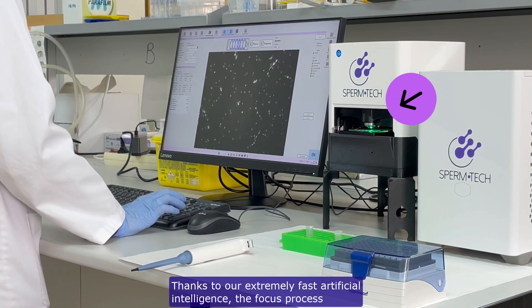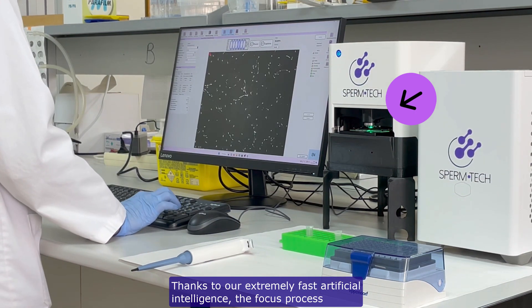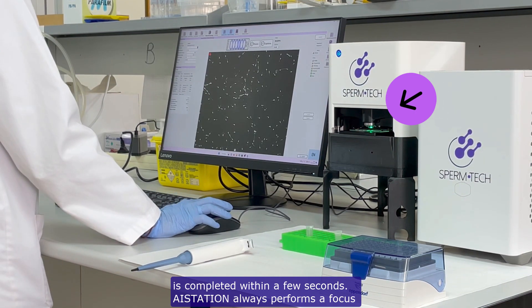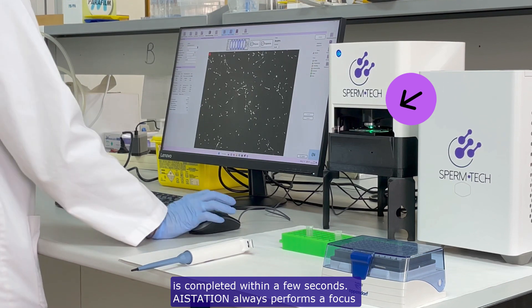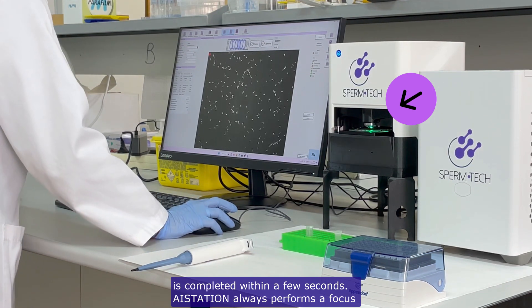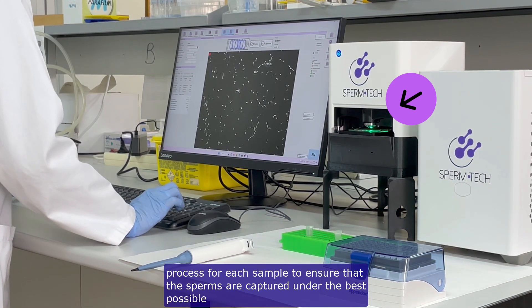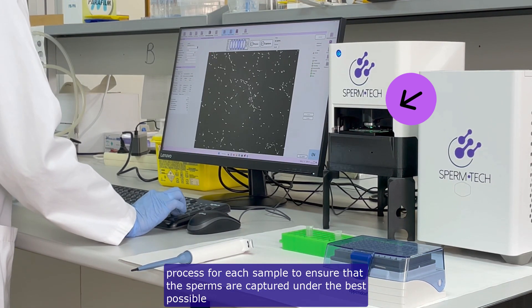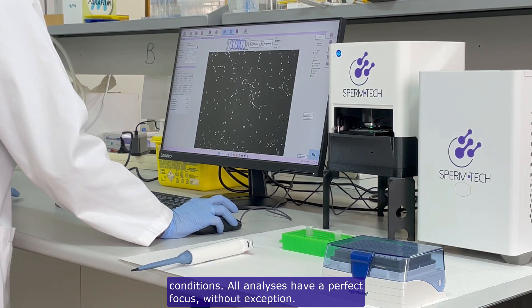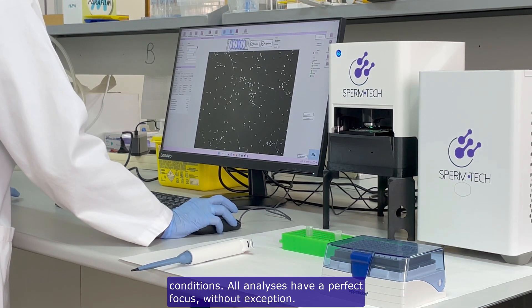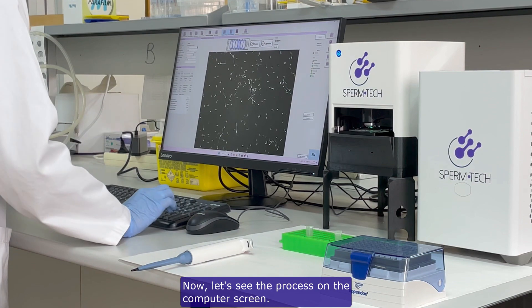Thanks to our extremely fast artificial intelligence, the focus process is completed within a few seconds. AStation always performs a focus process for each sample to ensure that the sperms are captured under the best possible conditions. All analyzes have a perfect focus, without exception.